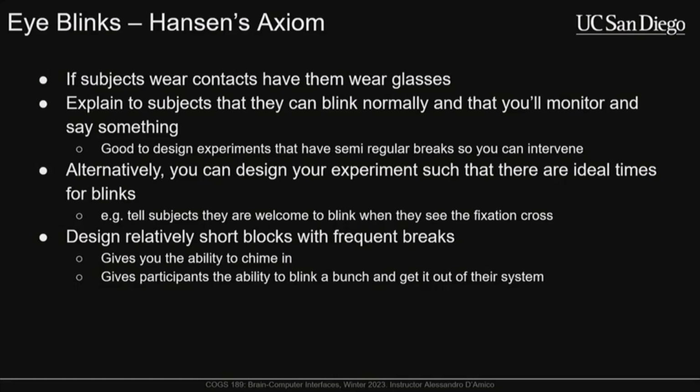Does that apply for eye tracking? Eye tracking is the other reason. So eye tracking is problematic with glasses. The reflections can mess up what the video camera is recording, which is a pitch for why you would want to use EOG-based eye tracking instead.